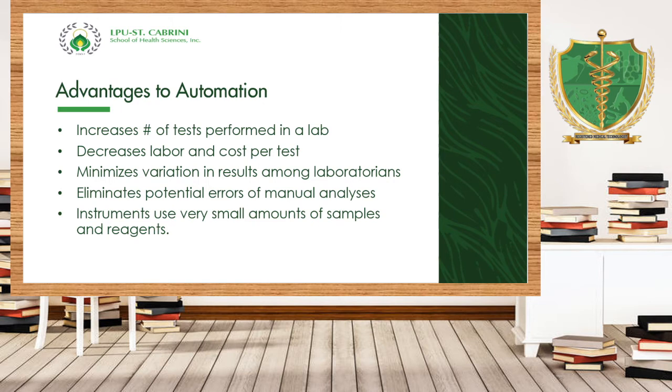Okay? Next, minimizes variation in the result among laboratorians. Okay? Kung natatandaan nyo yung sinabi ko sa inyo, yung isa sa pinagmumulan ng palpak na bagay sa laboratory, not the process, not the procedure, not the manual operating procedure, but the medical technologists who are doing the test. Okay? Yun yung mismong kauna-unahang dahilan kung bakit nagkakaroon ng problem in the analysis, most especially if we're doing the test in a manual method. So, with the use of automation, it allows us to lessen the variation among the medical technologists. No?